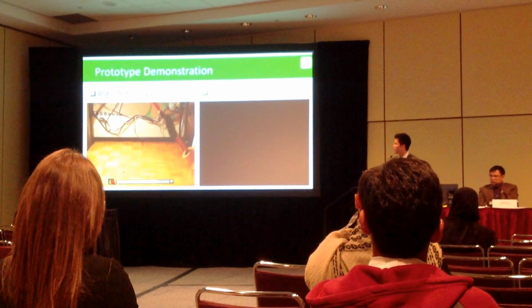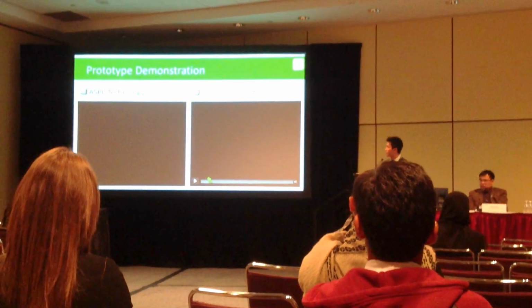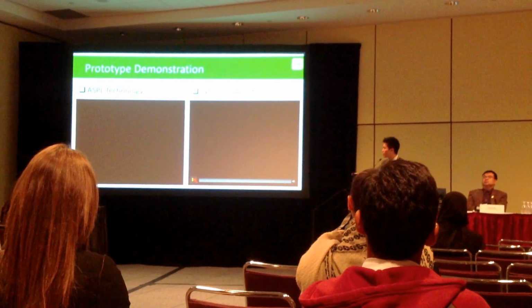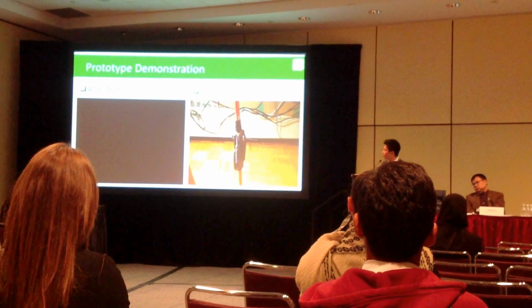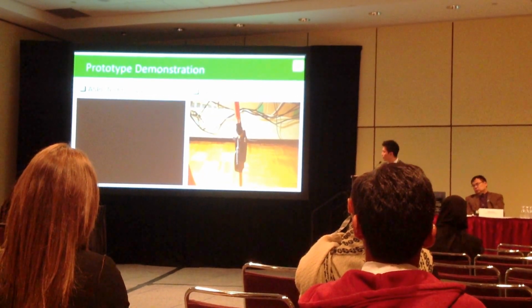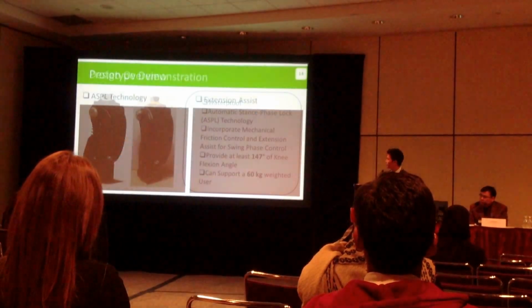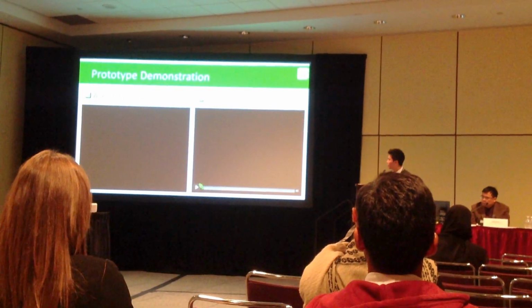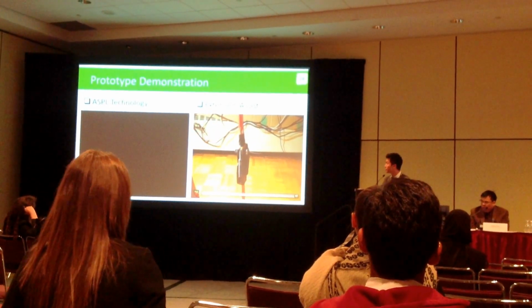And in this video, I try to demonstrate the spring extension assist. In here you can see that the spring can help the knee to return back to the extended position.